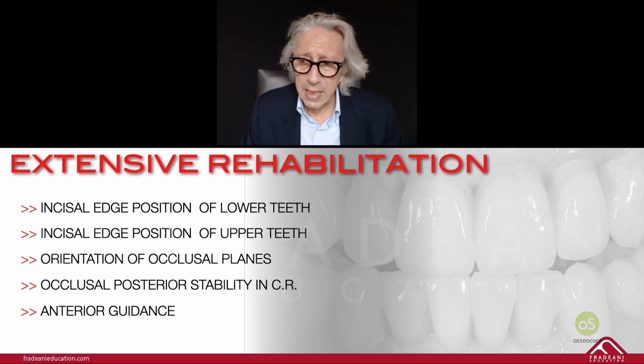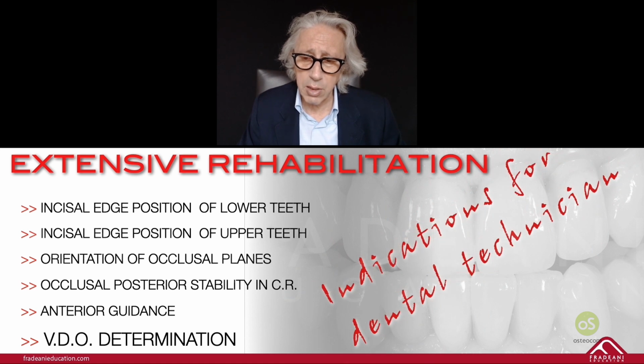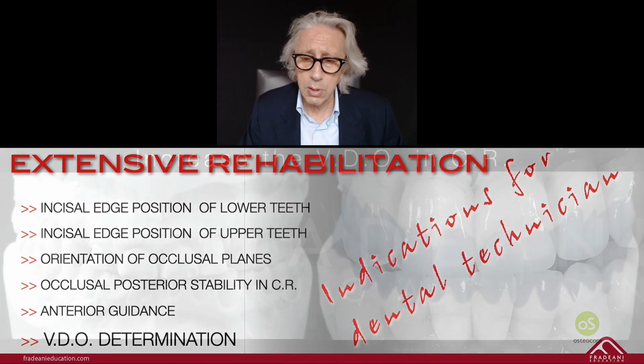It means incisal and cuspid guidance in order to exclude all the posterior teeth and avoid any kind of interferences. Last but not least, the increase of vertical dimension, as we said already, that's the big point. You need to determine how much to increase the vertical. All these steps are to be sent to our technician. And of course, they should receive this information, these indications, so they don't have to invent anything more. They don't have to become a magician to understand. They should just follow your instruction.